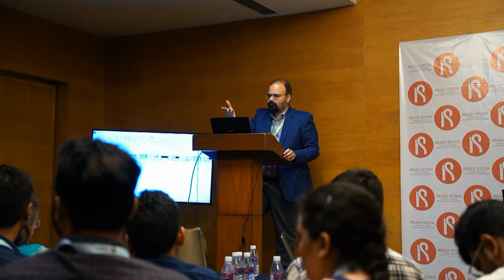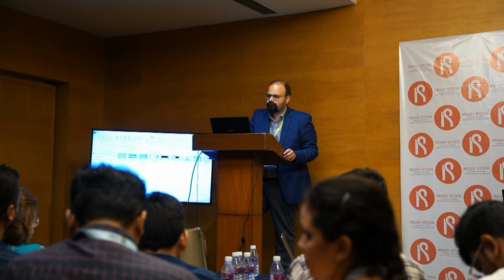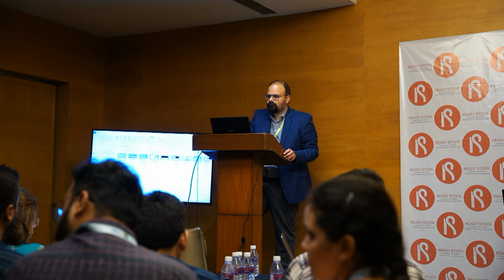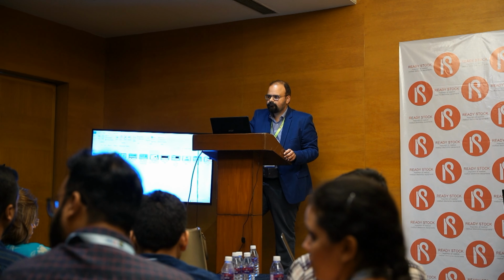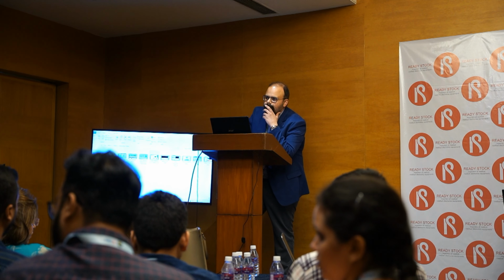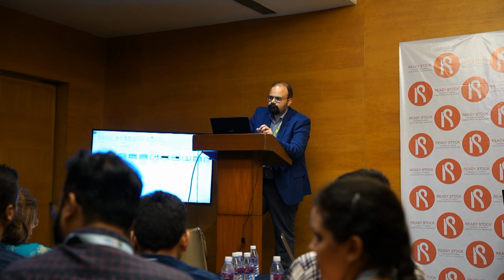I think your 50% is... Yeah, I know studies show 70-80%, but it's really case specific. The rest, I think a lot of patients just drop out. Most of them don't continue. If I started off with 10 biofeedbacks, maybe 4 or 5 only will continue. The ones who continue are the ones who do well.